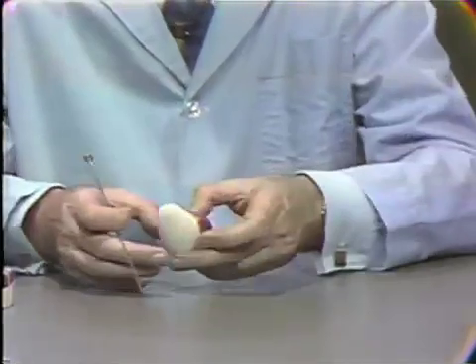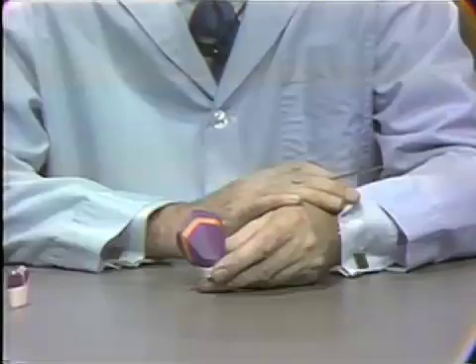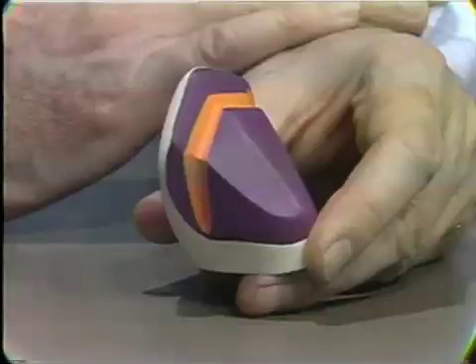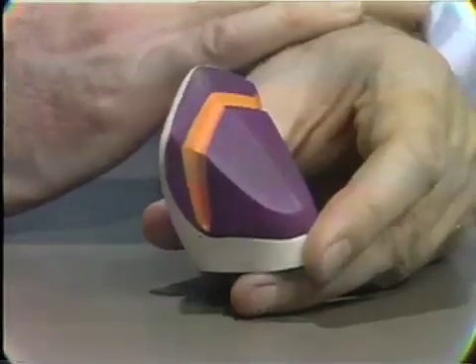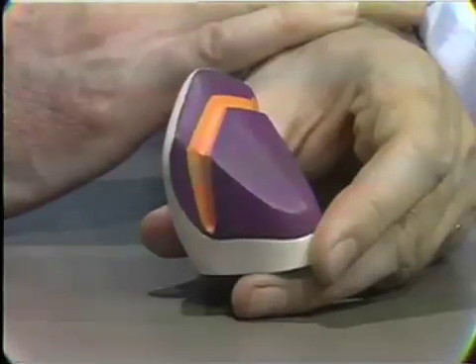Let's take a look now at the situation of the three-quarter crown on anterior teeth. And we have said that it's not so extensively used on anterior teeth as was the case in the past. It's been replaced to a large extent by the pin ledge restoration, which is easy to do technically and has the advantage usually of leading to better aesthetics.